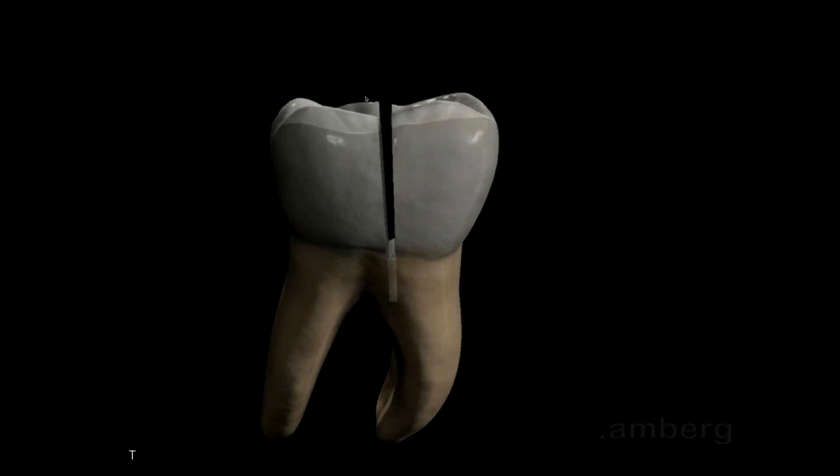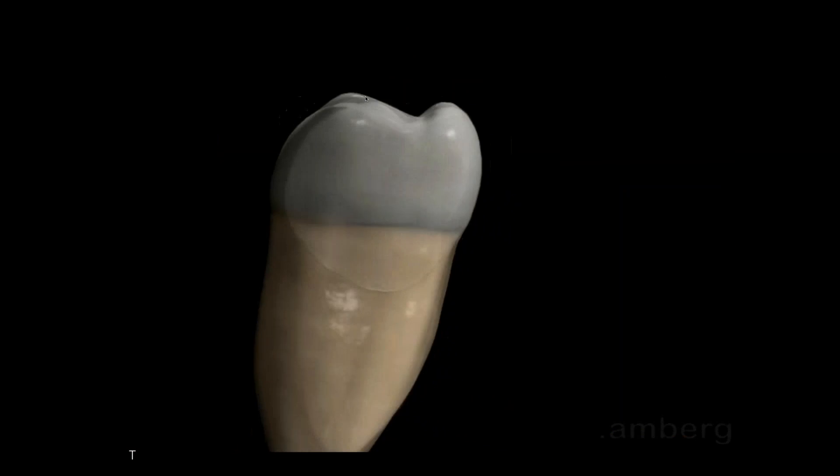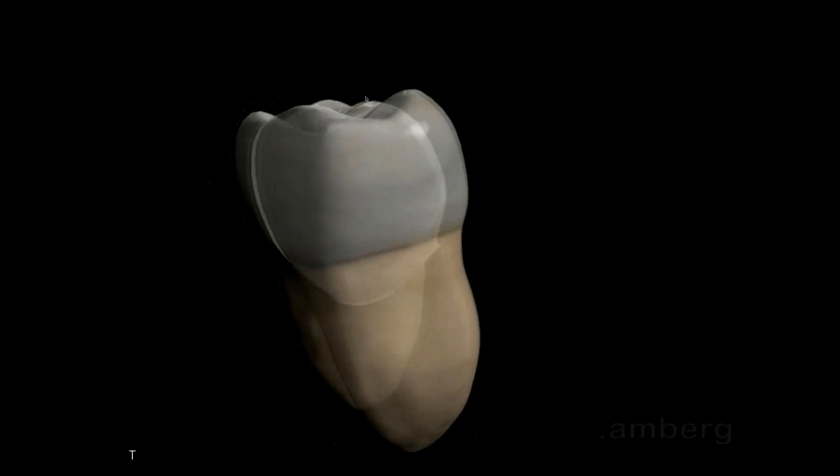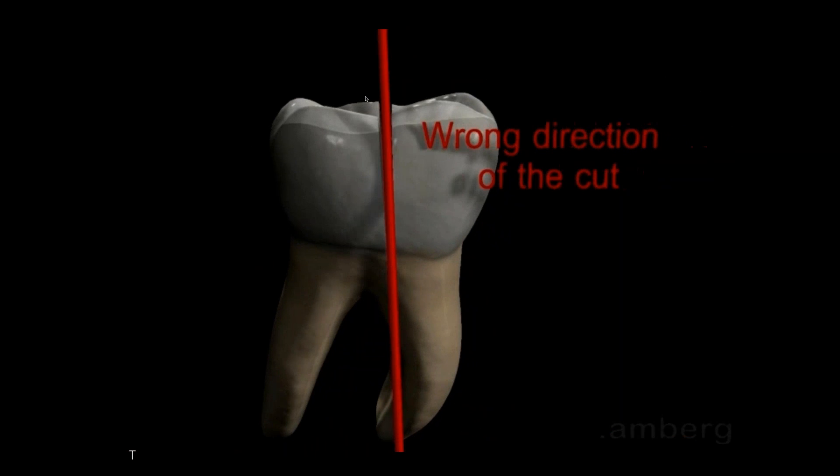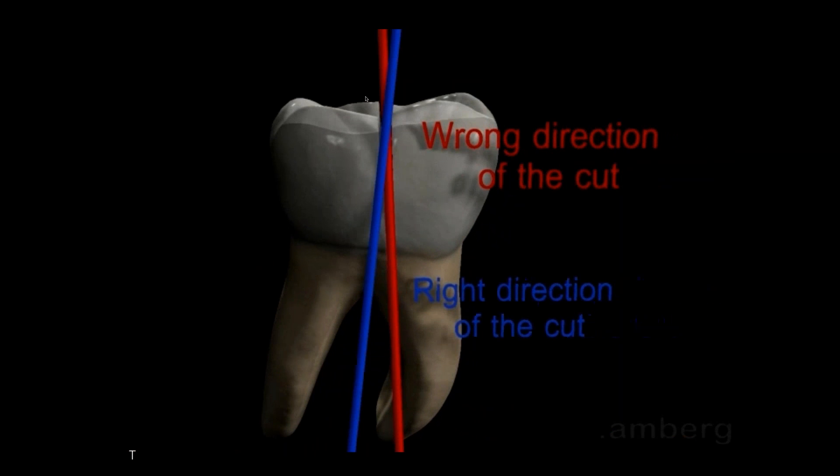It's going to be a challenge to remove. It's important that you realize you have to section through the furcation, separating the roots so that basically they are two separate roots — single-rooted bicuspid roots, so to speak.